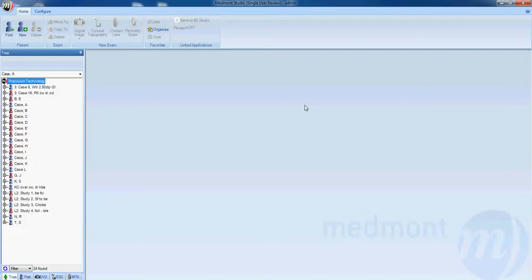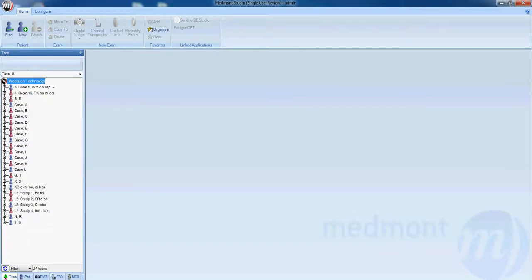This is video 4 on the basic operation with your MedMond E300 corneal topographer. You will note that your database is along the left-hand side. All patient information will be stored here.